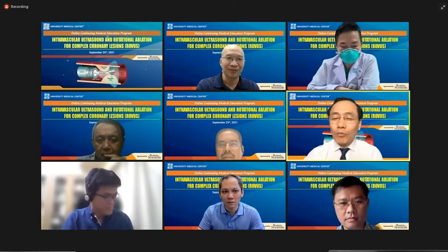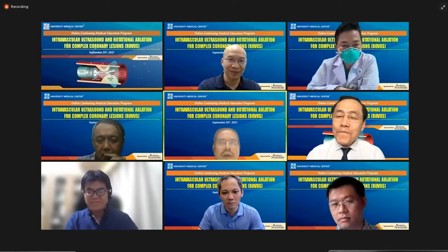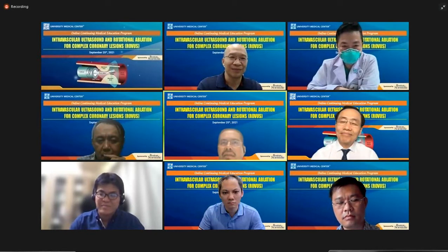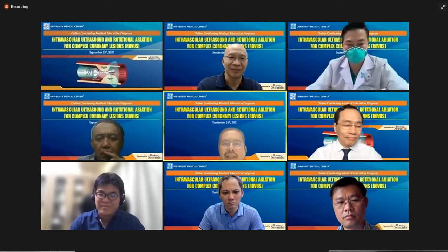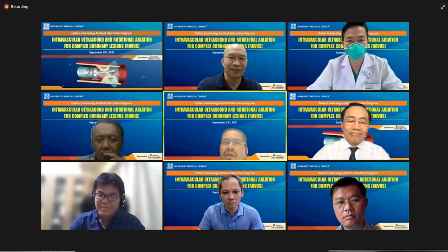So Professor Nguyễn Ngọc Quang, what do you think about it? Yeah, I think it is great, because sometimes when we see a bifurcation, we think that it is not a difficult case and we just go ahead with the stenting, and we get a problem with side branch occlusion and then we regret that we didn't use the IVUS from the very beginning. So I think we should think about side branch occlusion and use the IVUS as much as we can.